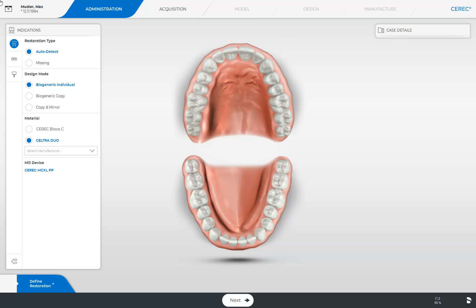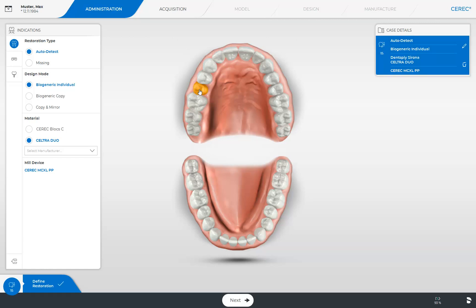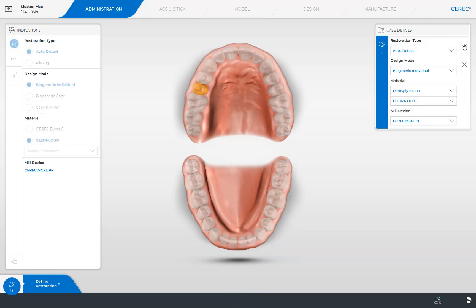After everything has been selected, all we have to do is tap the respective position in the odontogram. As a result, all specified information about this case is displayed in the window under Case Details. If necessary, you can edit your specifications again by clicking the pencil icon. Now all settings can be redefined by tapping on the respective drop-down menu, and for confirmation you then tap the little checkmark.